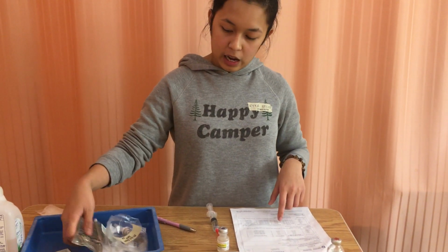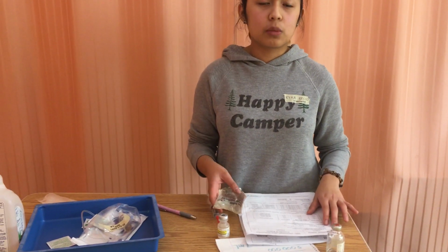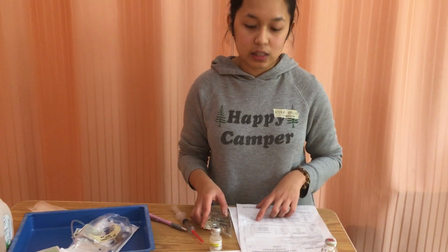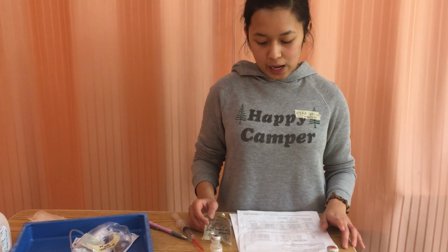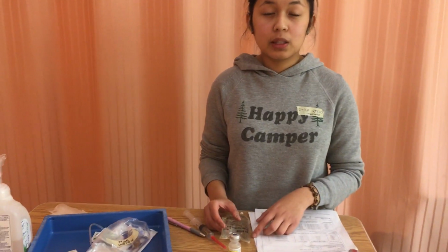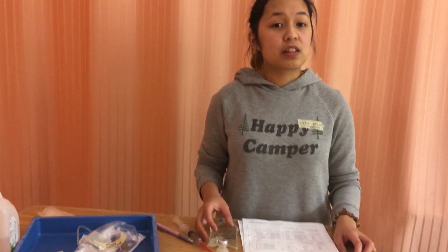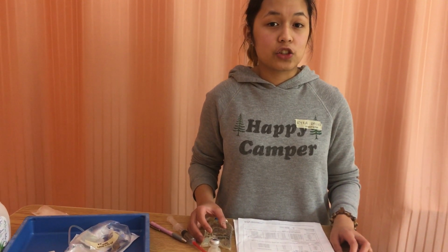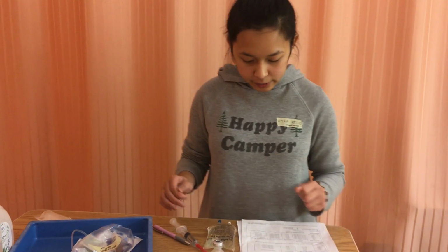So I chose to dilute this medication in 100 milliliters normal saline and run it over 60 minutes. Normal saline because the currently infusing line is already normal saline, so I know this is compatible. 100 milliliters because I want to decrease the risk of the patient getting fluid or electrolyte imbalances. And 60 minutes because this is the first time the patient is getting this drug, so I want to make sure that I can prevent any harm should it occur.